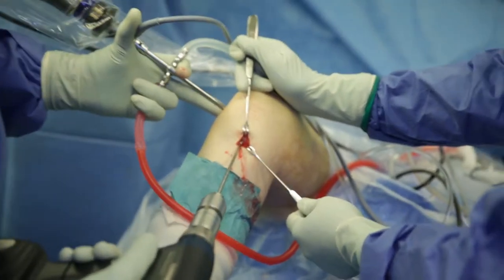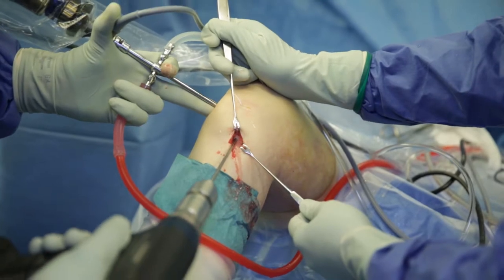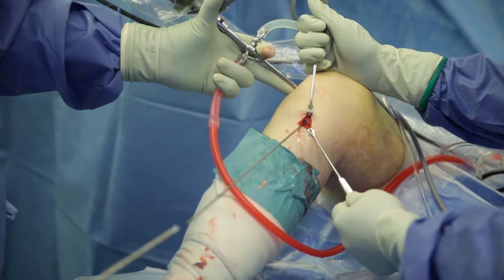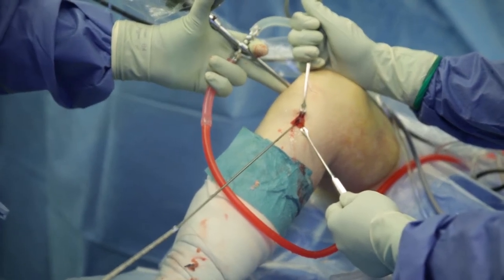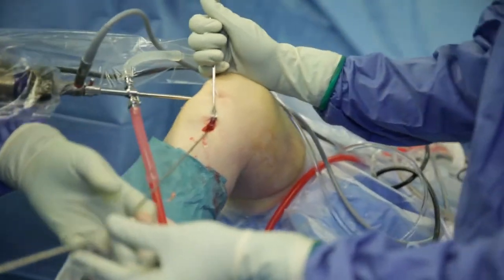up to the articular surface. And now we're reaming the new channel, as you see, a little bit more posterior, so maybe half of it is in the old tunnel area. This would be a classical indication for two-step revision. We do it now with this system. You can do it in one step.